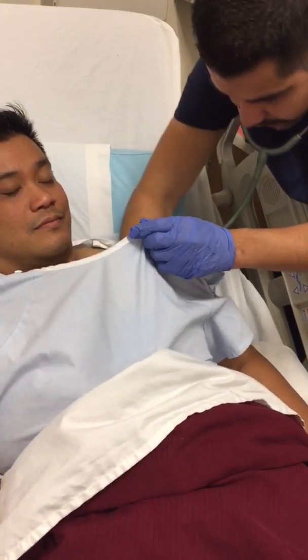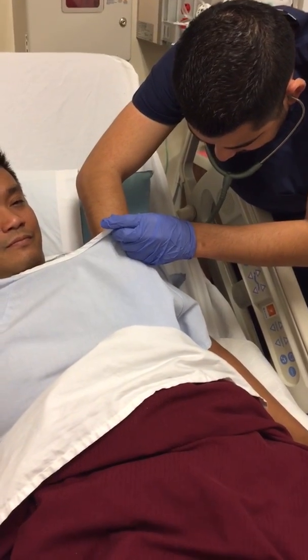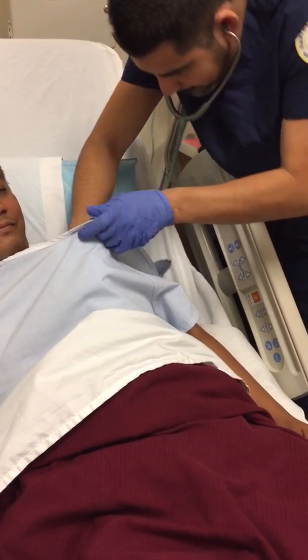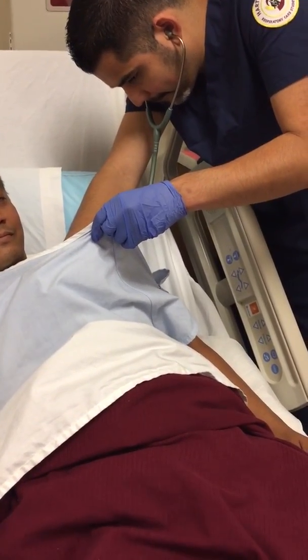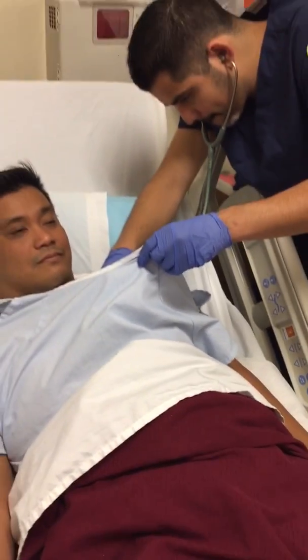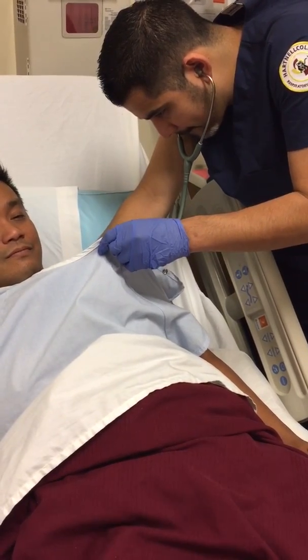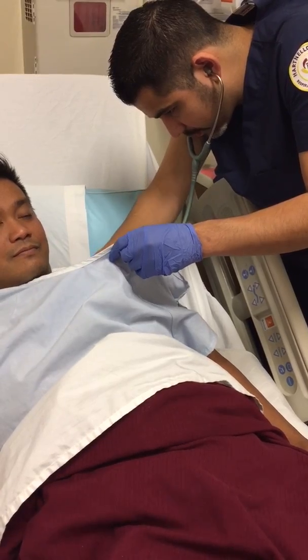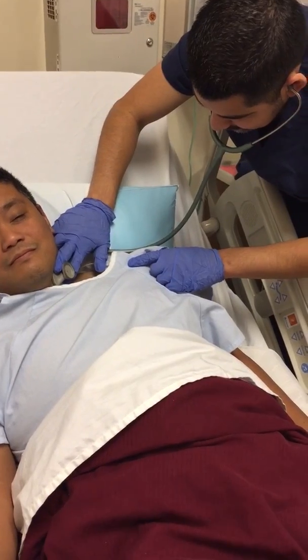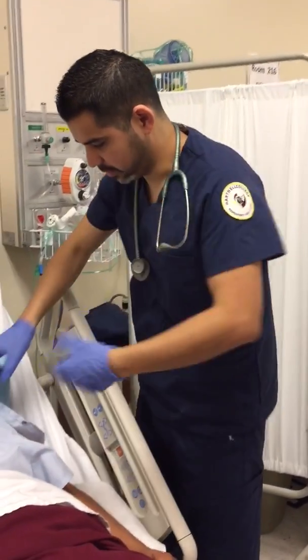Doing a great job so far. All right, go ahead, take a deep breath here. Now I'm gonna listen to your neck, okay? All right, good. I don't hear any wheezing on those airways. I'm just gonna button up your gown.